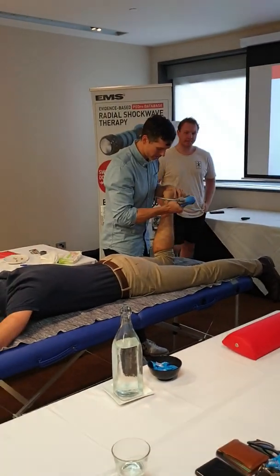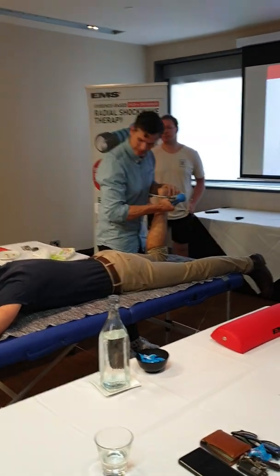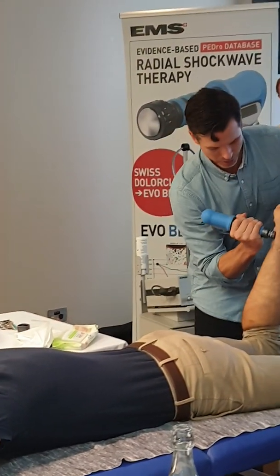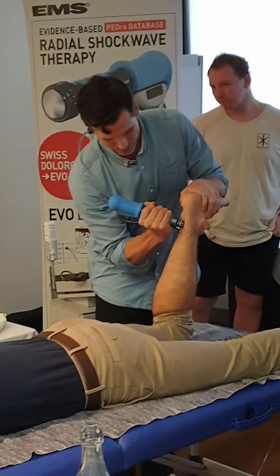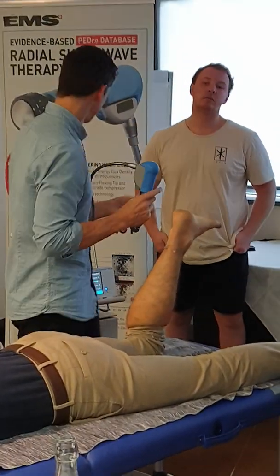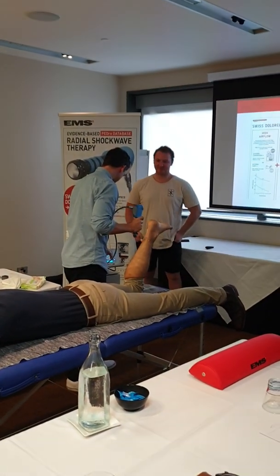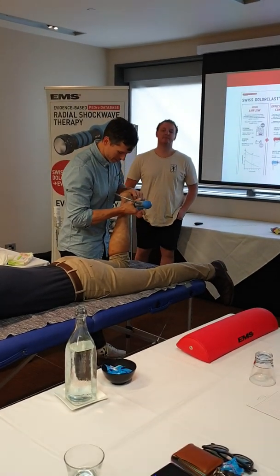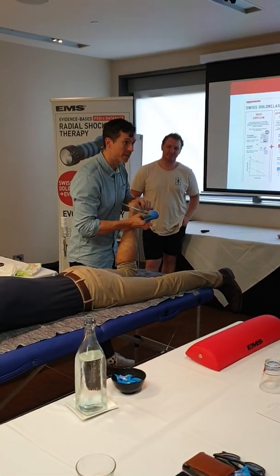So let's start here. What's that out of 10? 3 or 4. Yeah. What about on this side? 1 or 2. So this is it. We want them to have more fun while it's here, have an experience. So we'll put it up a bit. What's that now? 6 or 7. So we hit our sweet spot. We're up to 7.